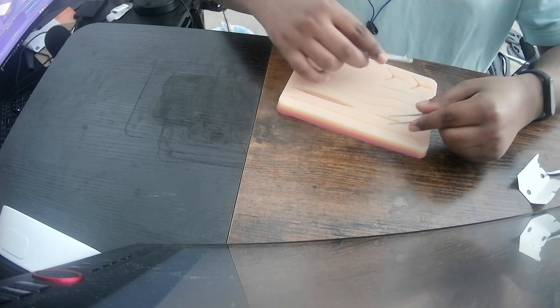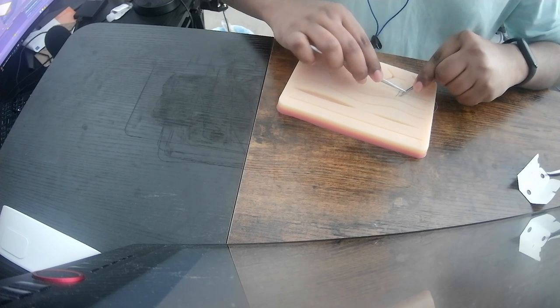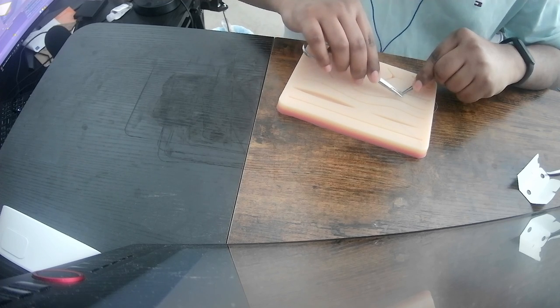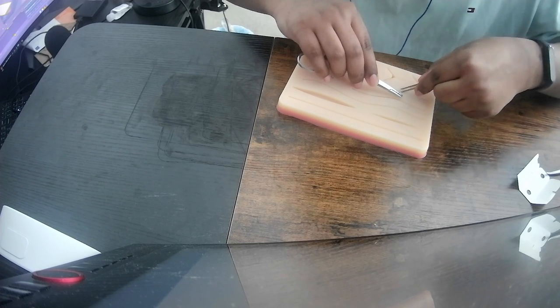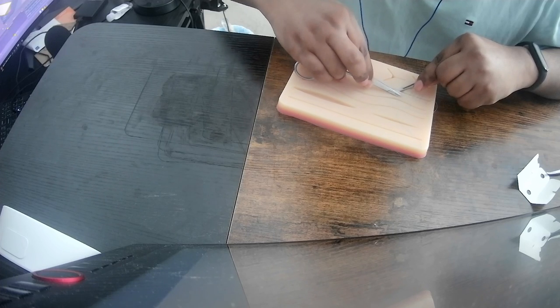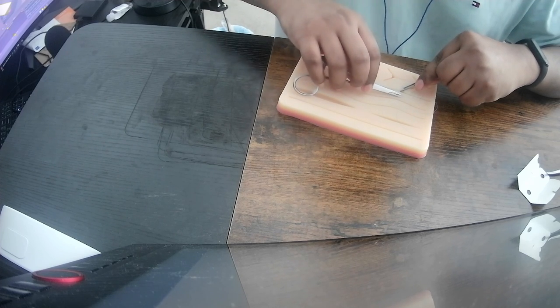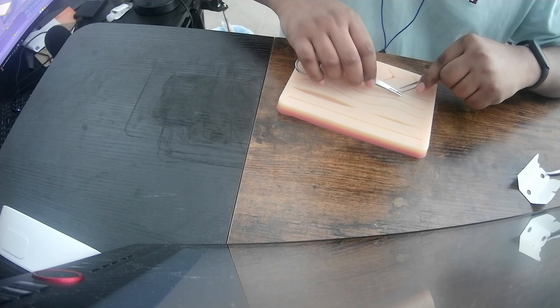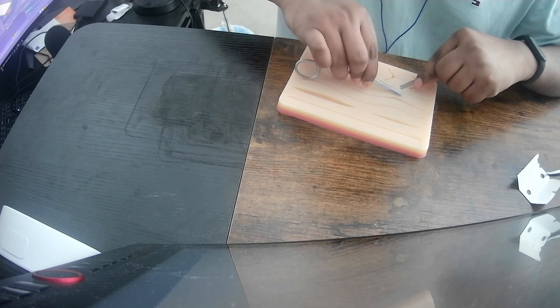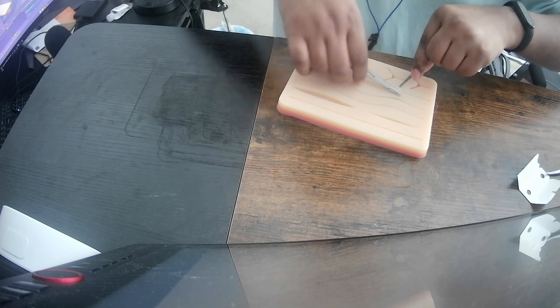Man, the stupid suture is getting in my way again. Let's try again. This time. Okay, now for the other side. I think I dug into it. Just go with it though. That looks too much. I think I dug in too much.